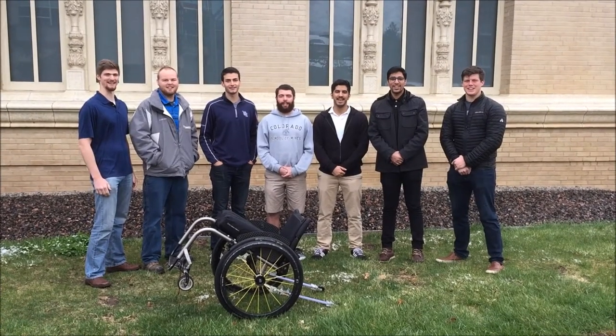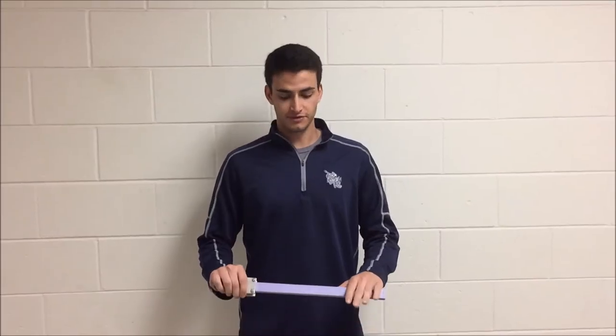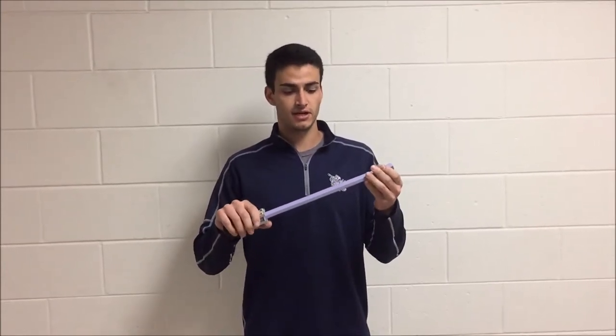We are Step Up Mechanics and this is our project. We were asked to create a wheelchair attachment to help safely traverse curbs. After a few design considerations, we came up with two arms that are going to be attached to the back of the wheelchair.